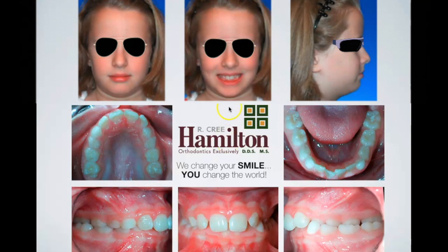Okay, so you bring it down and forward a bit. Now, it needs to come forward, we mentioned that. Does it really need to come down that much? You could afford it to come down a little bit. When she smiles, she has incisor display, a little bit of gingival display. It's definitely not going to hurt. But what else about what you see is going to be different after you expand? Yeah, look at the smile itself. You can see those buccal corridors, how narrow the smile appears from a purely aesthetic standpoint. So is that a justification?